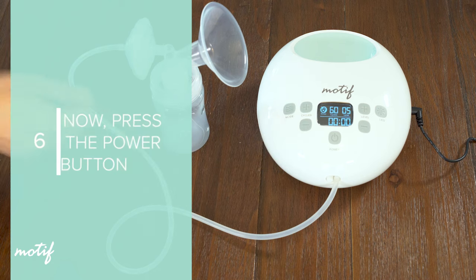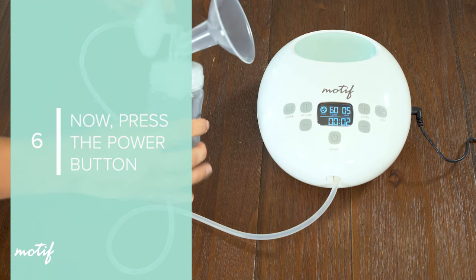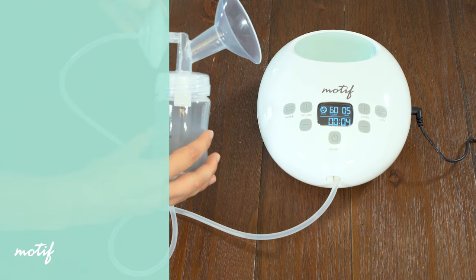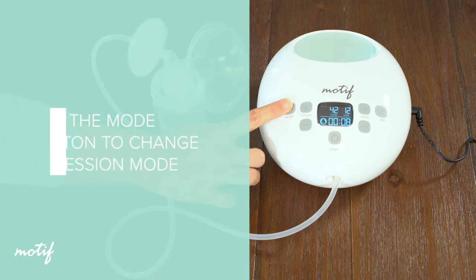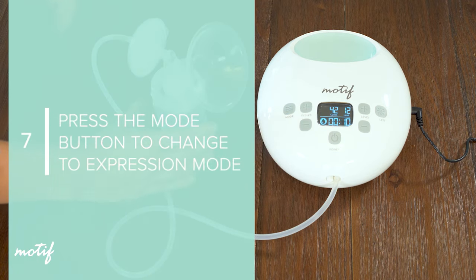Now press the power button. The Luna will power on, indicated by the screen lighting up. It will automatically begin in massage mode to help with a faster letdown. Press the mode button to change to expression mode once your milk starts flowing.